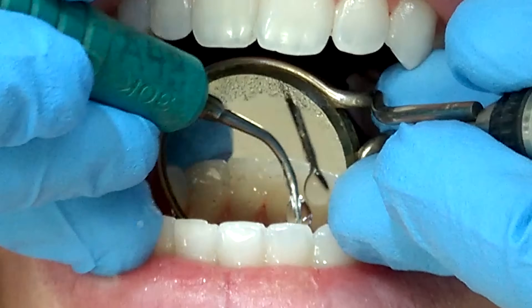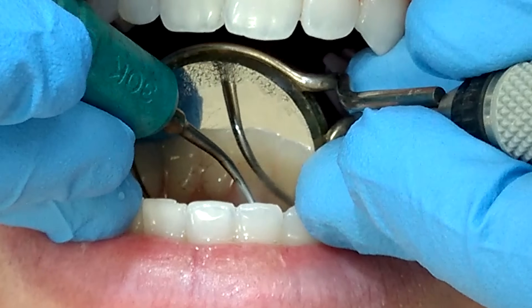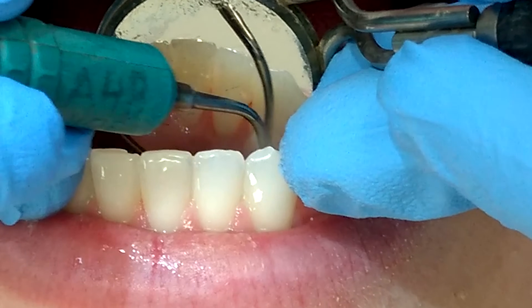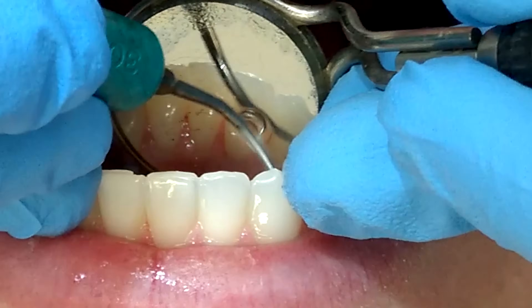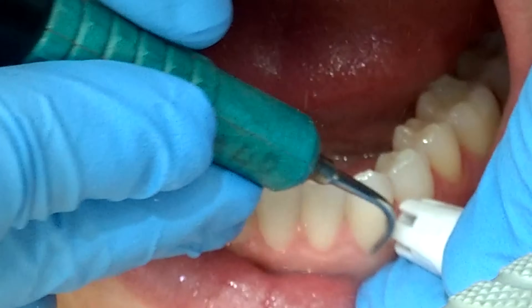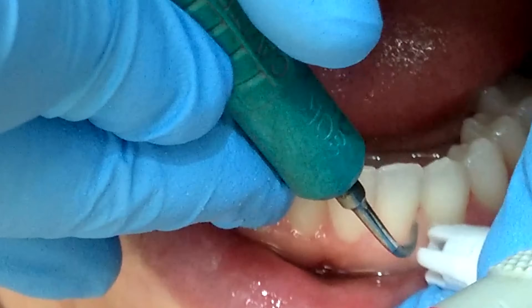There is also a lot of talk about not using the ultrasonic on newly erupted teeth for a few years. But on occasion you may end up needing to, and it might be more beneficial to the patient. In that instance, I'll turn it to a very low setting and just use it to remove biofilm and plaque and irrigate out the gums, even if it is a newly erupted tooth.